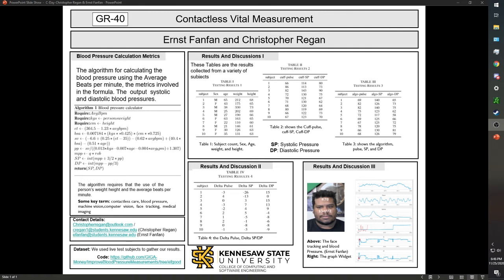We're thinking about not using those first couple of seconds so we can get a more accurate pulse that will be translated into a more accurate systolic and diastolic pressure, because this time around we did not meet the standards for medical devices.